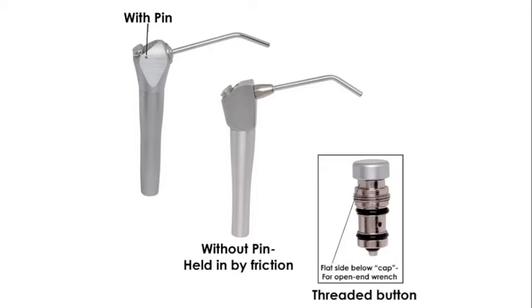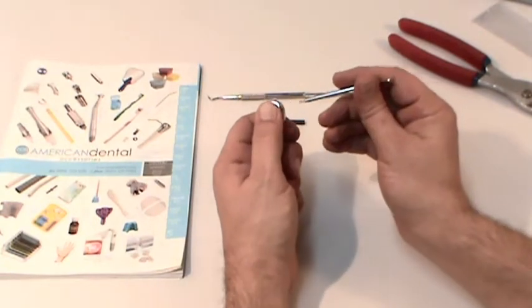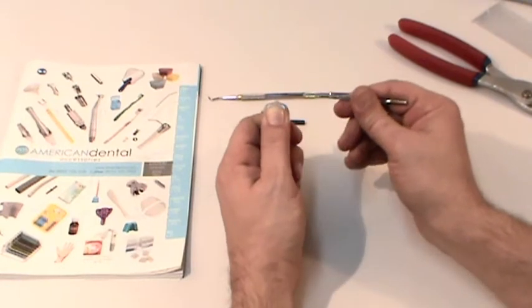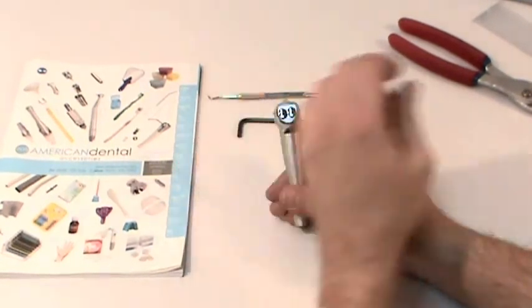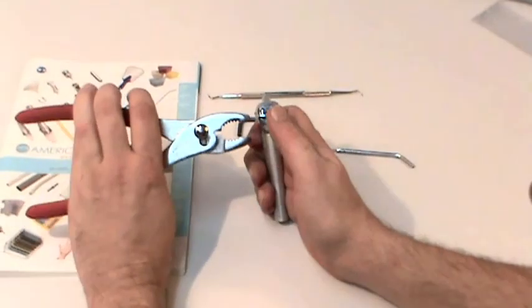Some ADAC syringes use a small set screw to retain the buttons. In order to remove the retaining pin, push down both of the buttons and use the skinny end of a metallic syringe tip or even a stiff paperclip to push the pin out. Once you have gotten the pin partially out, you can use the pliers to pull the pin the rest of the way.